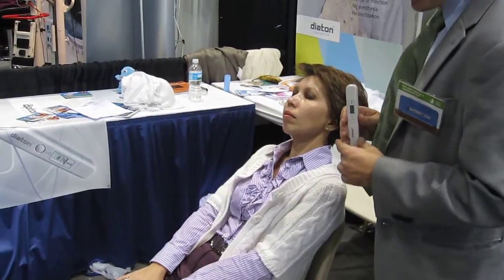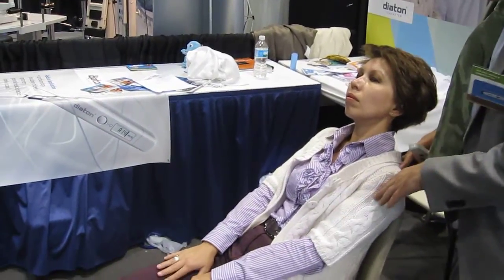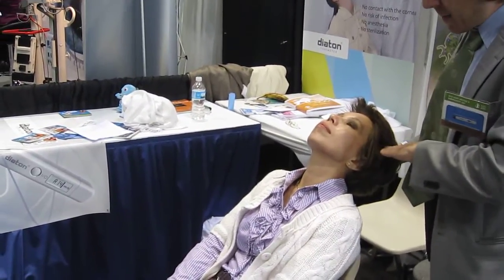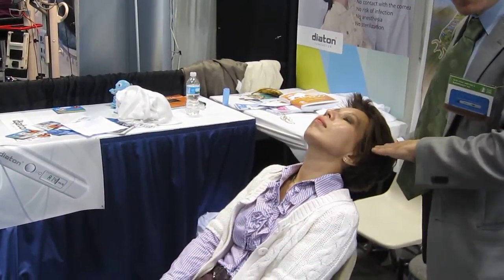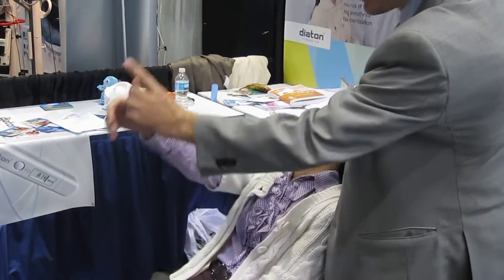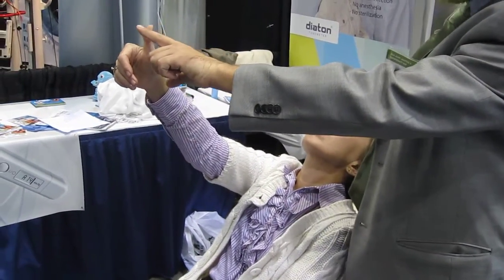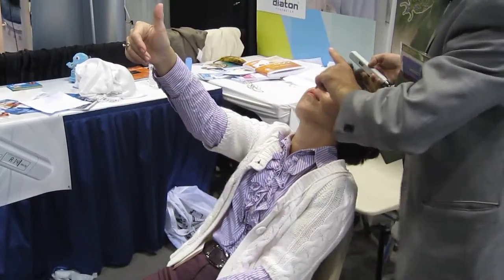Positioning of the patient is quite important. You want to make sure there's some angle on the patient's back in order to have less of a tilt angle on the head. The head should be as horizontal as possible. Extend the patient's thumb in front of them at approximately a 45-degree angle to center the eye.